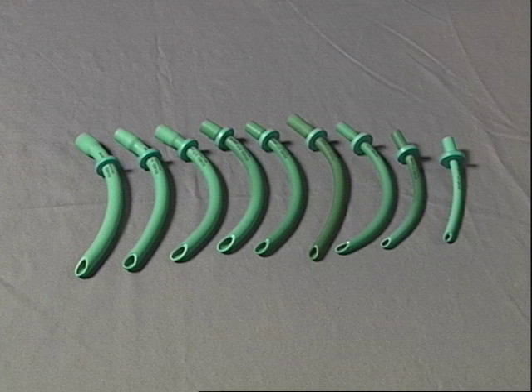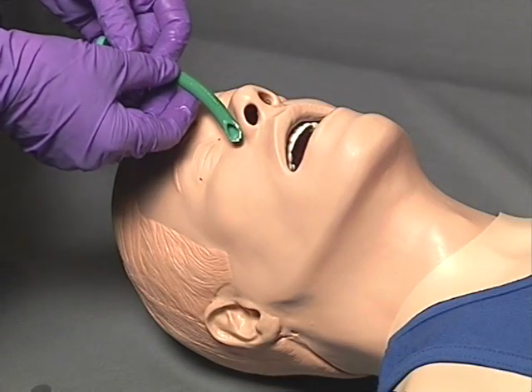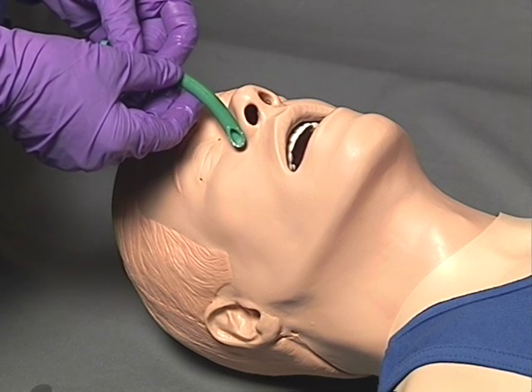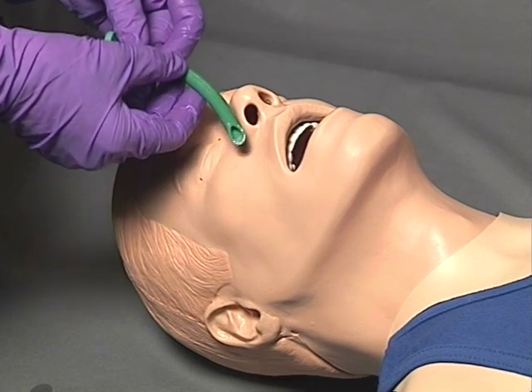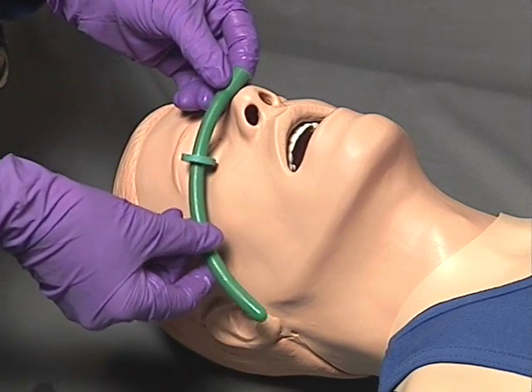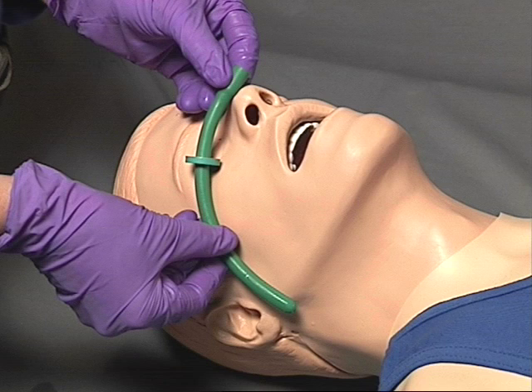Nasopharyngeal airways are produced in a variety of sizes to accommodate various patients. To select the correct size nasal airway, begin by visualizing the patient's nares and select a nasal airway with a diameter slightly smaller than the patient's largest nare. Once the diameter is determined, measure the device from the tip of the patient's nose to the tip of the earlobe or angle of the jaw.